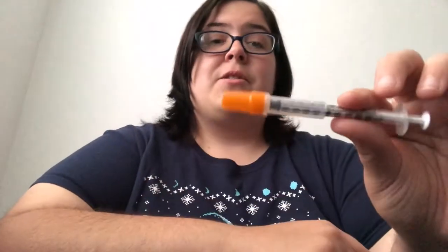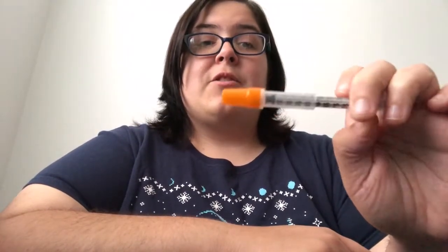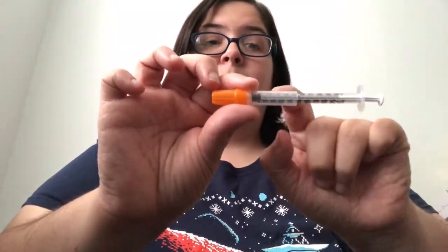Now I'm going to show you how easy it is to use this safety feature right here that you can see. You can see where it's skinny and then it gets bigger right here.